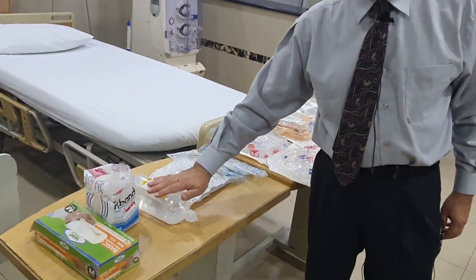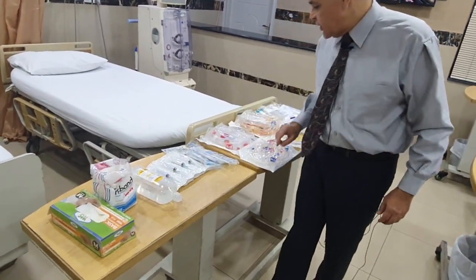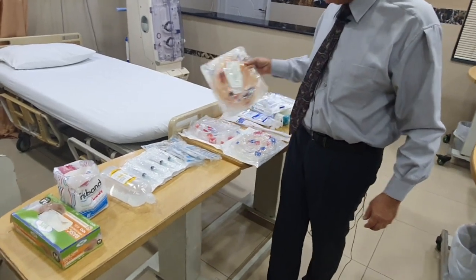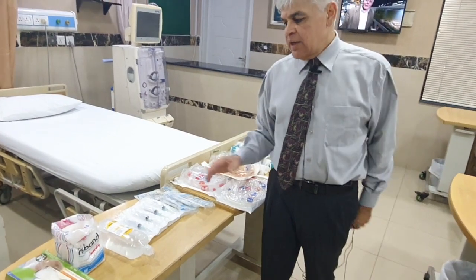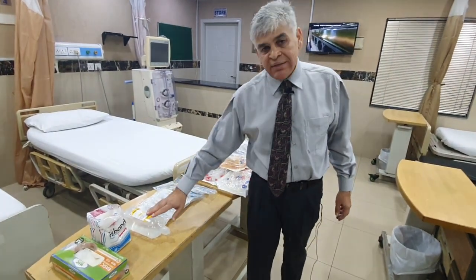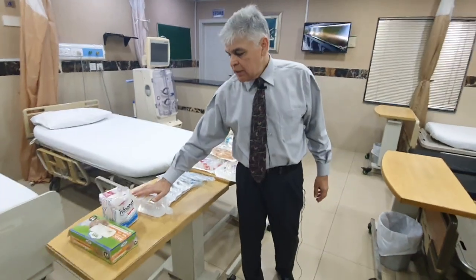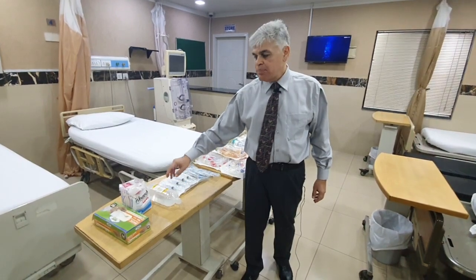So once you've primed the machine, and when we say priming of the machine, it means that this saline goes into the blood tubing line and the dialyzer, and this is called the priming fluid. The approximate amount of priming fluid is about 200 to 300 ml. It depends really on the size of your blood tubing line and the dialyzer, but it's roughly between 200 to 300 ml.